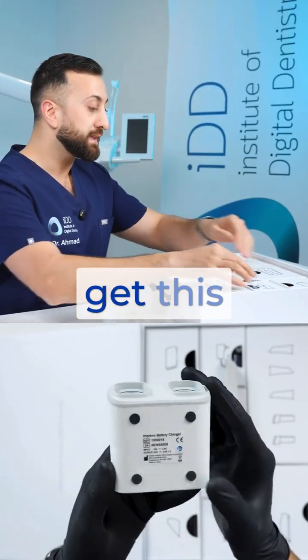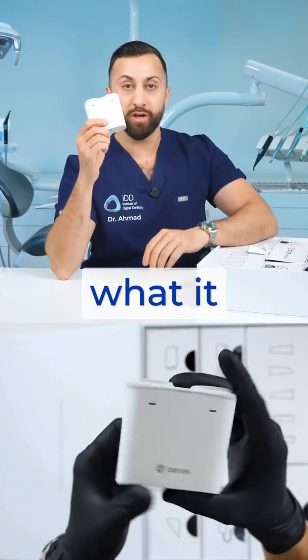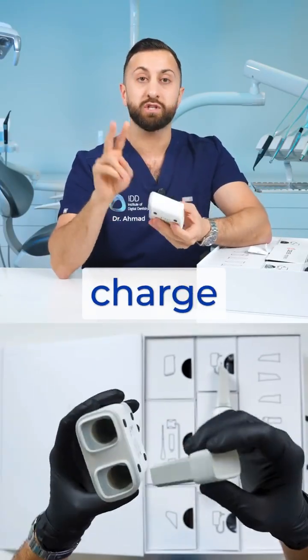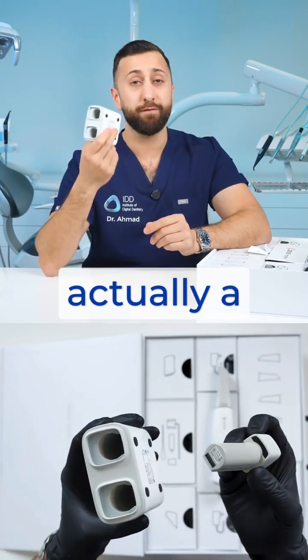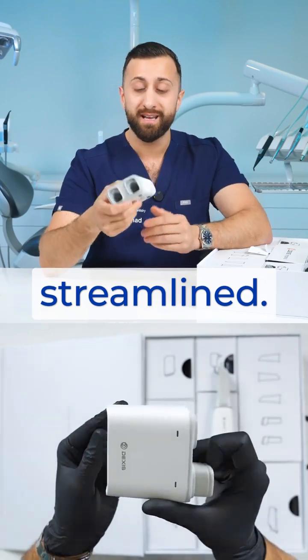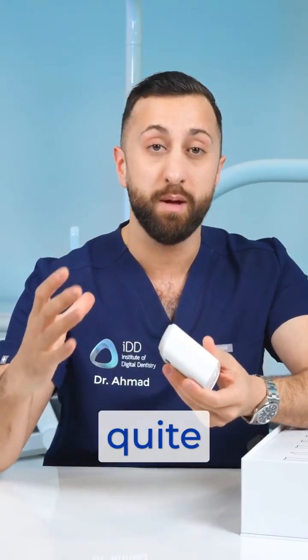Let me get this separate battery charger out — this is what it looks like. You can plug this into the wall and it will charge two batteries. This is actually a very small battery charger; I quite like it, super streamlined. Some of the battery chargers that come with these scanners are actually quite bulky.